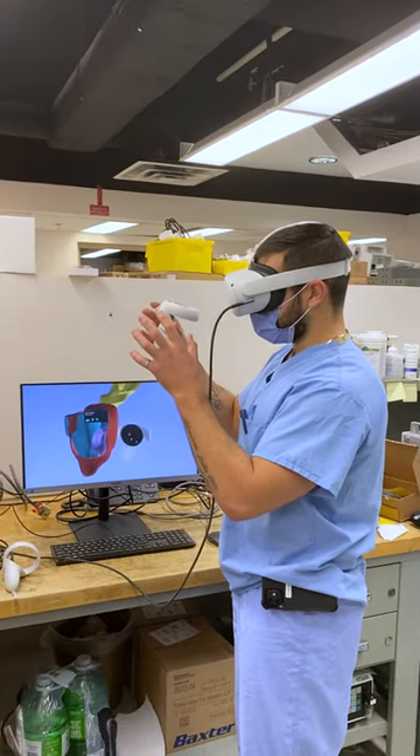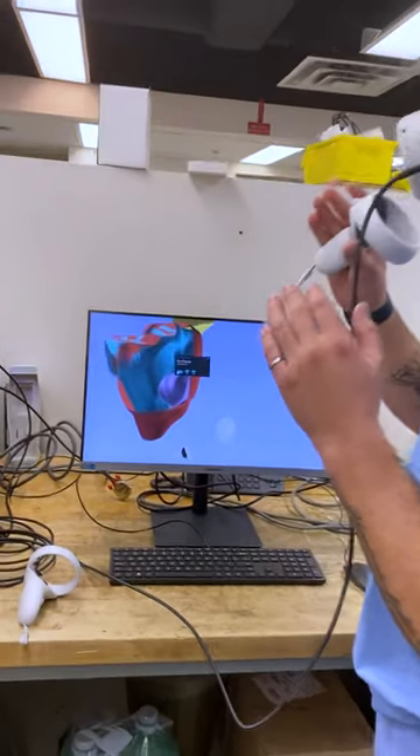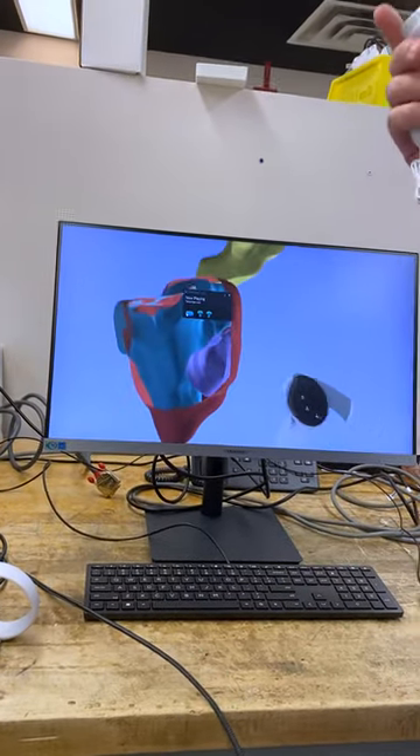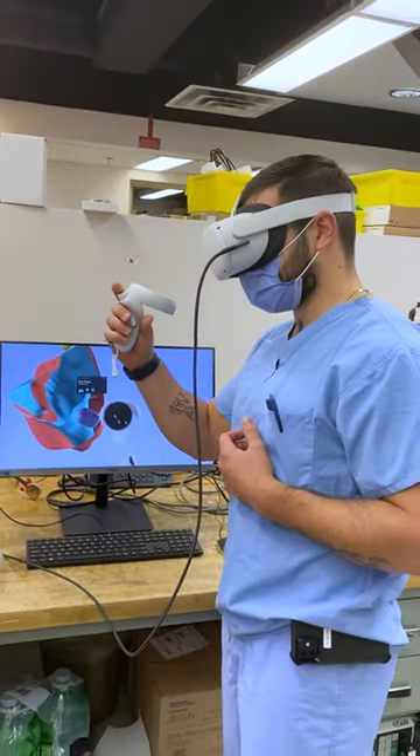The red is the peripheral zone, the blue is the transitional zone of the prostate. Using the VR, I can give additional depth to the tumor itself. It just gives you a better perspective of the model and the anatomy you're looking at.